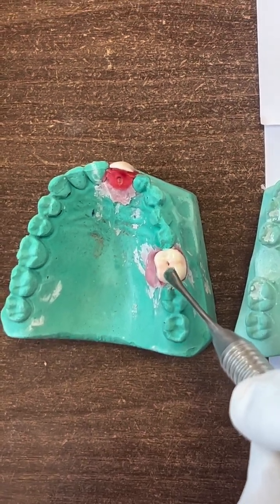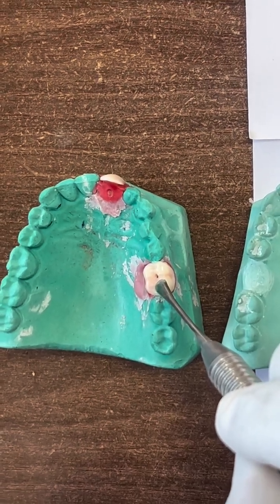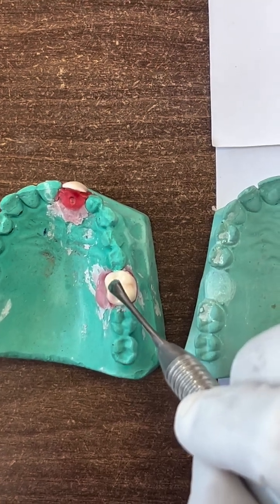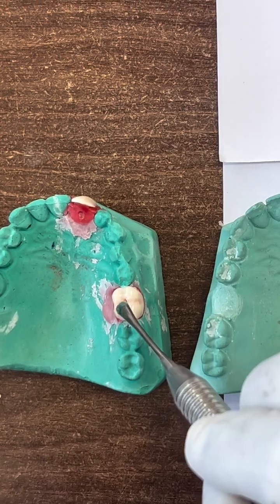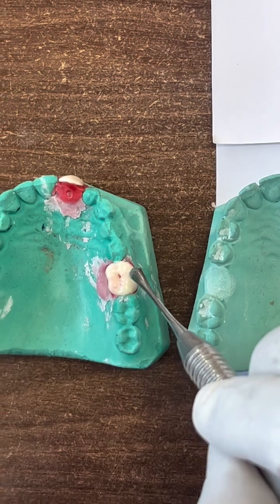Of course, we must take the basic fundamentals of implantology into consideration, which include the space between the implant and the tooth, the space between the implant and the implant, and the space between the implant platform and the buccal bone.